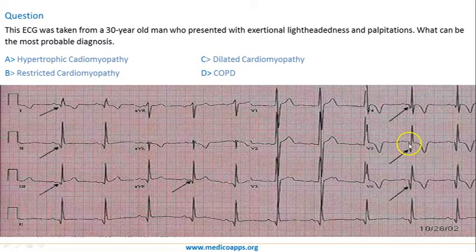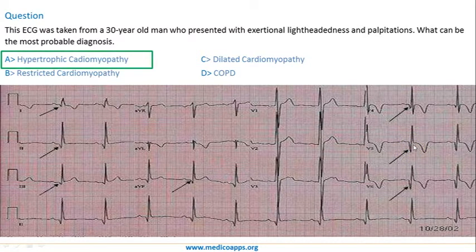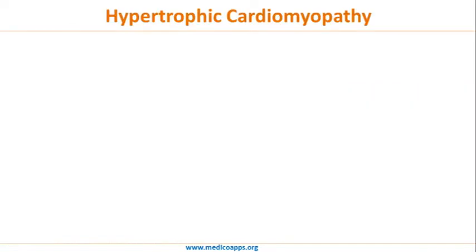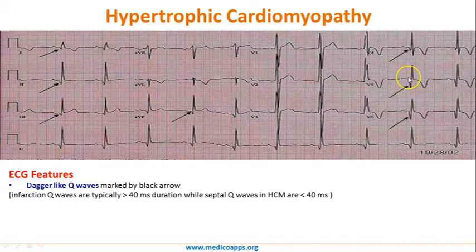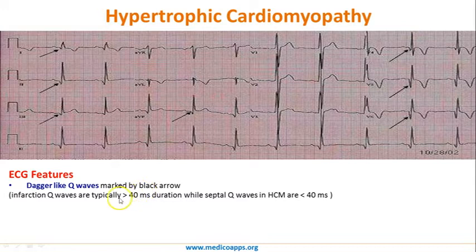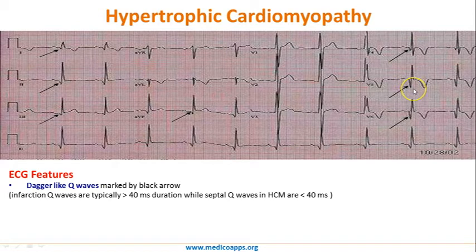These Q waves are characteristic of hypertrophic cardiomyopathy. Now we know that dagger-like Q waves are marked by the black arrow — they almost look like a dagger. Pathological Q waves are also seen in infarction, but they are relatively broader. In hypertrophic cardiomyopathy they are narrow and deep, which almost looks like a dagger.